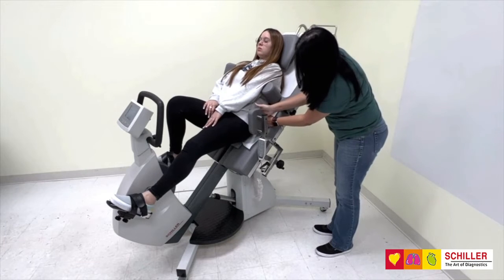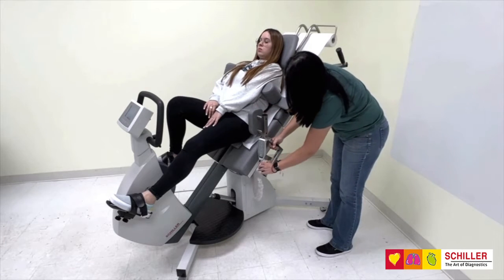The depth, height, and length of the hip support can be adjusted individually for each patient.